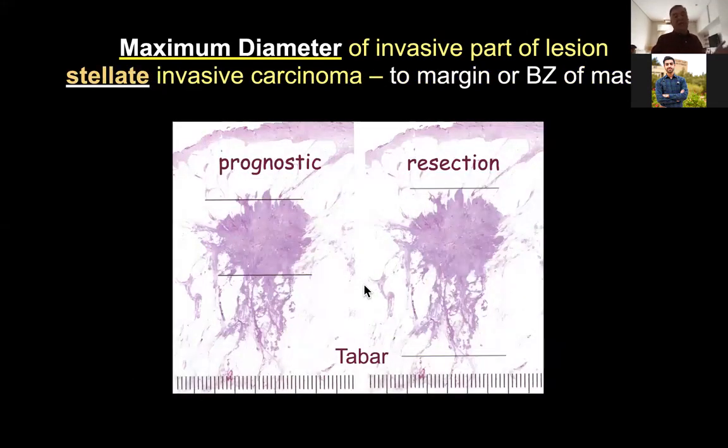Now, this is a little different. This is an invasive lesion that's spiculated. And in this case, here's a case where I think the ACR ultrasound BI-RADS is not quite right, because the ultrasound BI-RADS says you should only measure the hypoechoic central nidus as the size. And I'm going to show you on some histology slides that there's microscopic tumor in the thick echogenic rim in virtually every case. And so it's wrong to exclude that. The thick echogenic rim is part of the lesion.